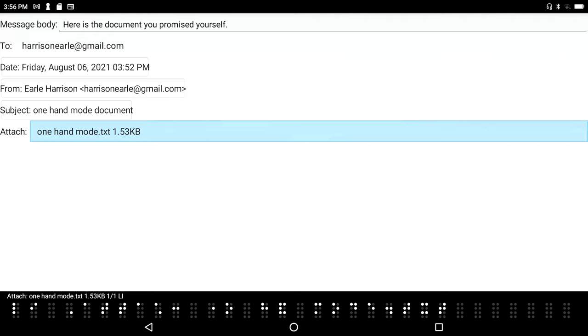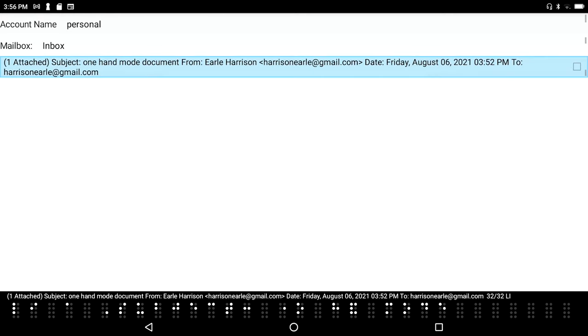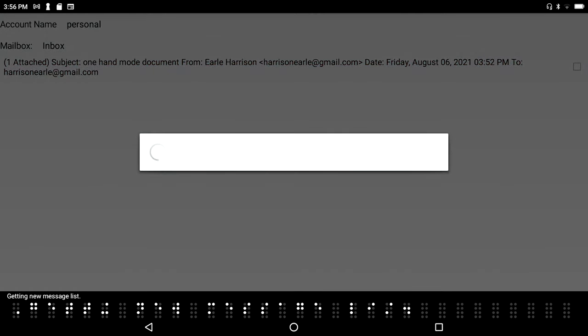This time when I go check my new messages - I'm still in the body of this old message, so let me get out of here. I'll press F4, then enter N for new messages. Getting new message list.